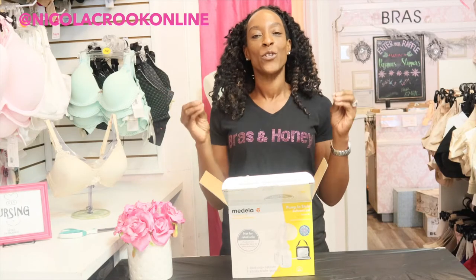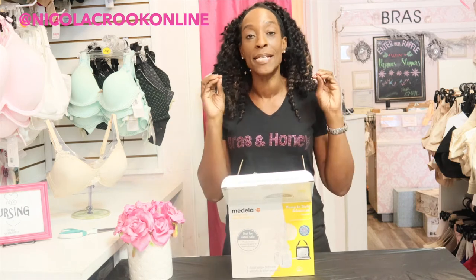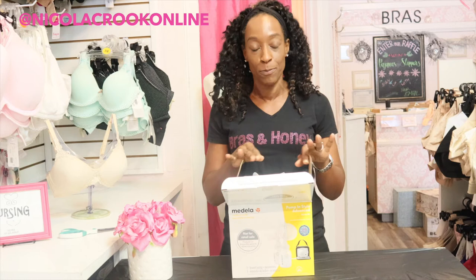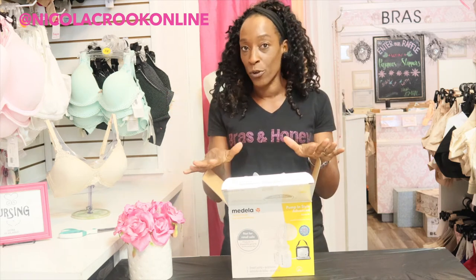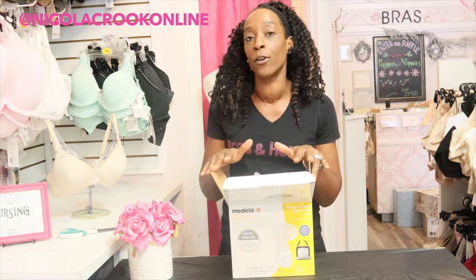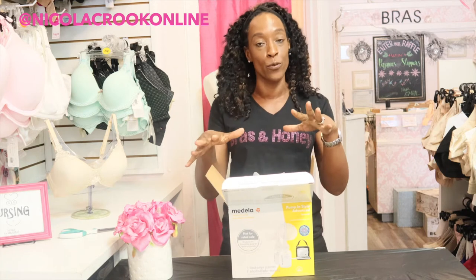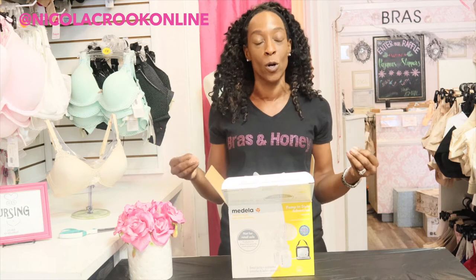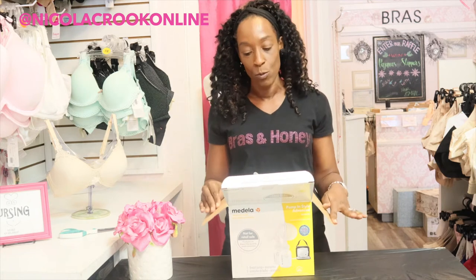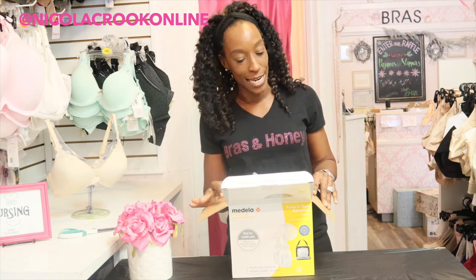Hello and welcome, thank you for tuning in. In today's video I am doing an unboxing of the Medela In Style Advanced breast pump. For our US viewers, I'm sure you're aware that your insurance will pay for a breast pump when you're pregnant, and this is the breast pump most insurance will pay for. Medela is the number one choice for pregnant and breastfeeding ladies — it just has a really wonderful reputation.